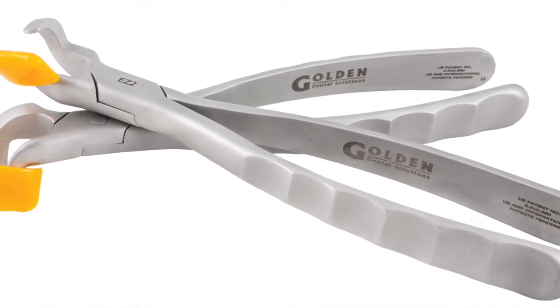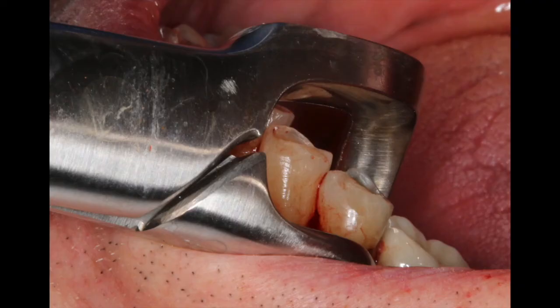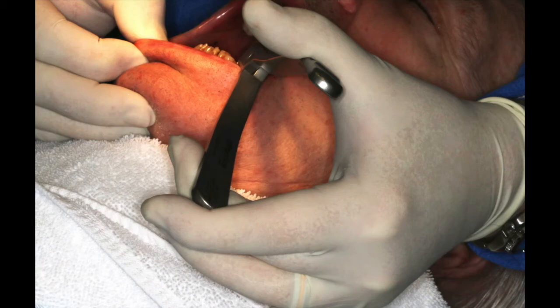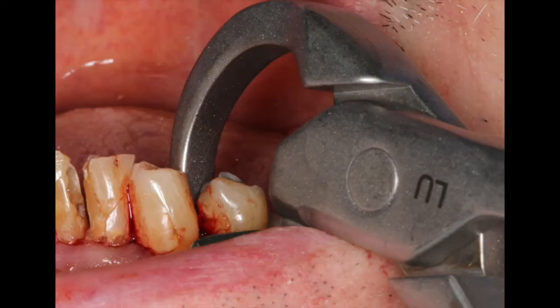We also have a molar series of Golden Dent forceps, which allow us access in more challenging areas. You can see that the instrument is very effective, placing the beak or the shovel-shaped part on the lingual surface. We're never squeezing the instrument — rather, we're just rotating our wrist, allowing the tooth to come up and out of the socket. The bumper is simply a fulcrum or center of rotation. The tooth will disengage as we get a physiologic response, an enzymatic release, which breaks down the periodontal ligament.